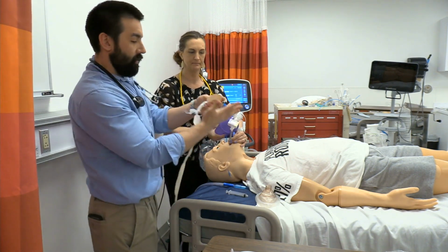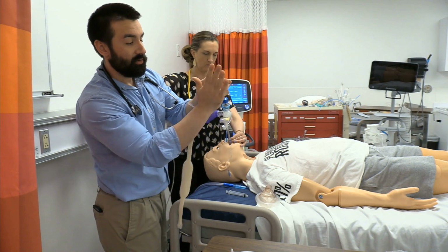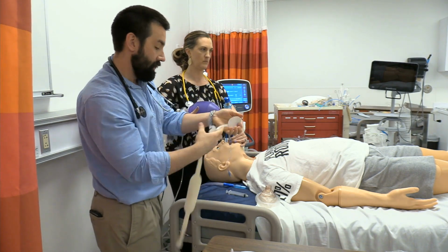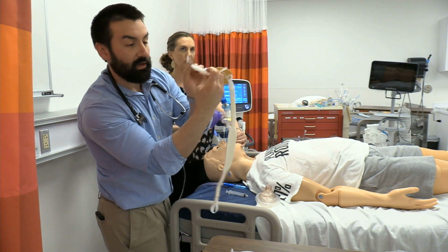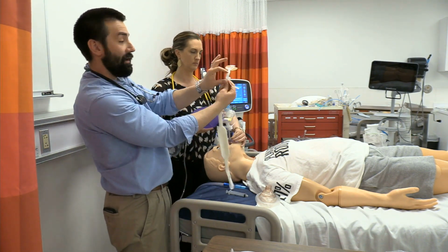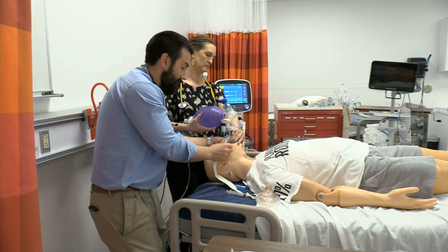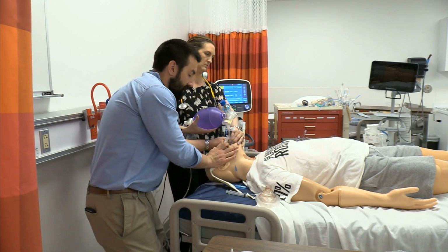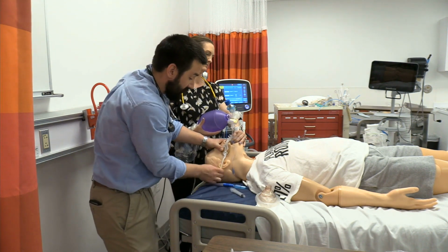It was boring. So we take the adhesive off here, or the adhesive backing, but we're not going to on this one. I usually warm it up just a little bit. You want these little plastic teeth on this tube holding device to be biting down on the tube. We'll try and get it centered here. I put a little bit of contact up above the lip with that foam, kind of push down until it sets up. That adhesive's very strong.